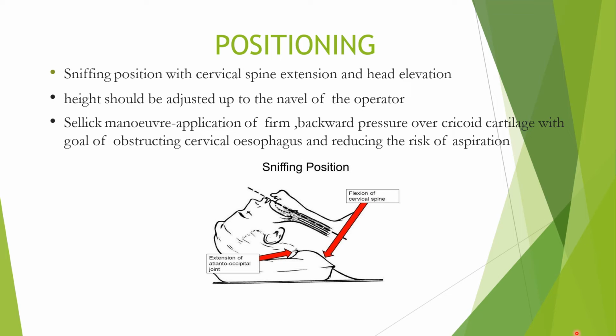Sellick maneuver: application of firm backward pressure over the cricoid cartilage with the goal of obstructing the cervical esophagus, and it reduces the risk of aspiration.